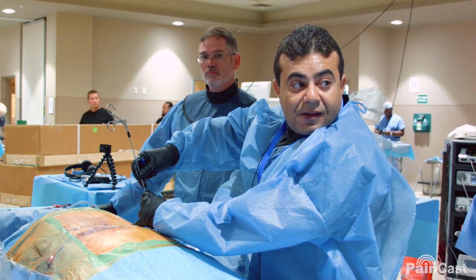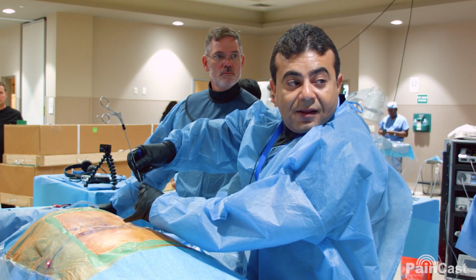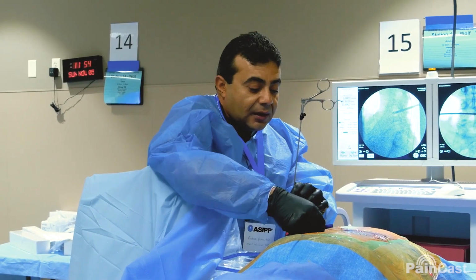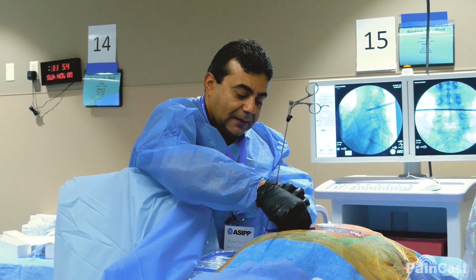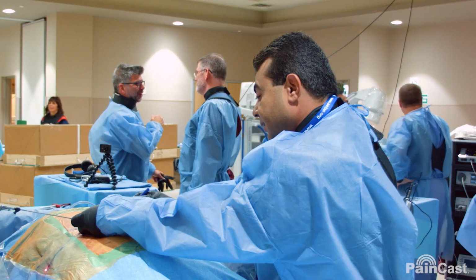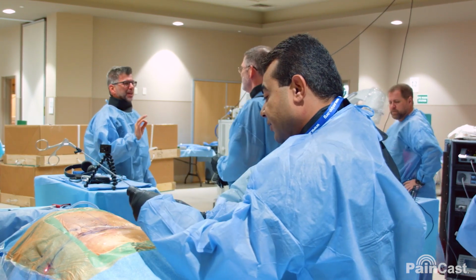X-ray. So that is the trajectory you want to go in. Want to make the marking how deep we're going to go. So we measured the distance. Then we take that distance. That's going to be our lateral. Go laterally. That's where the marking is going to be. And we're going with the same trajectory.